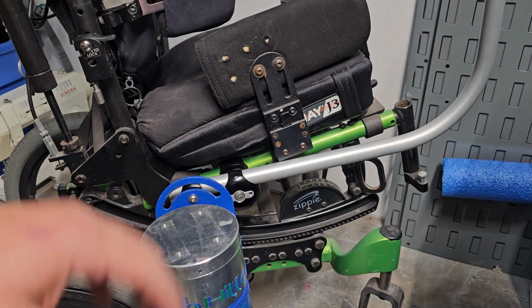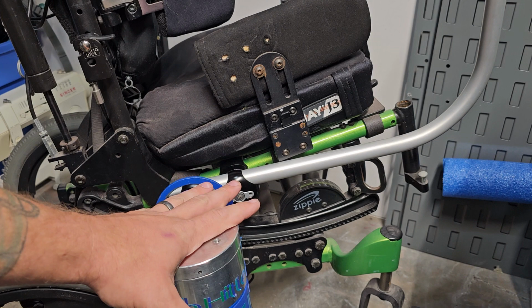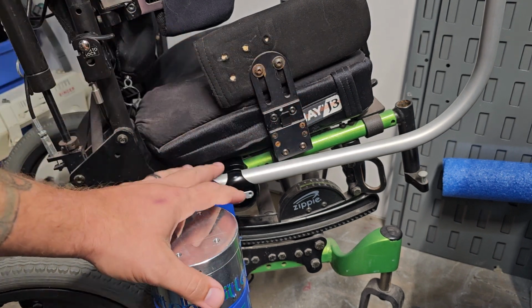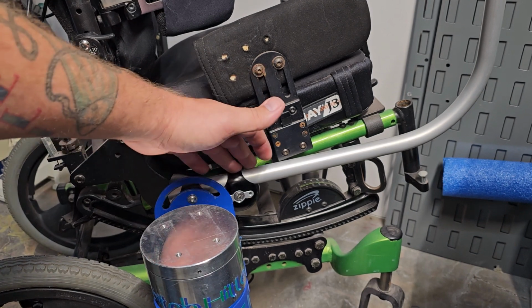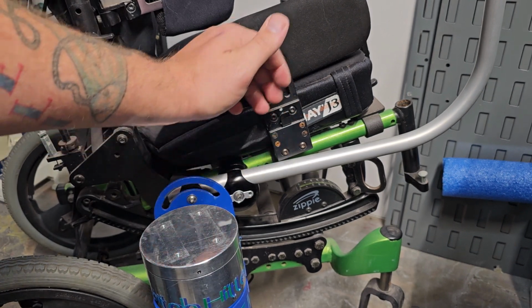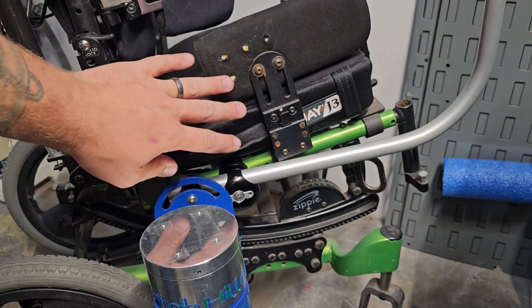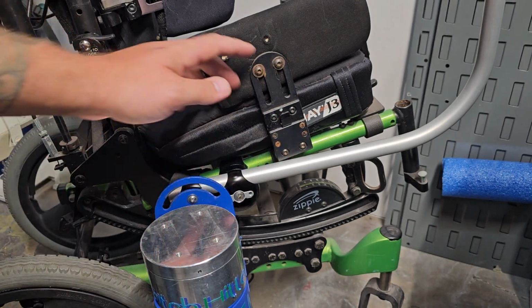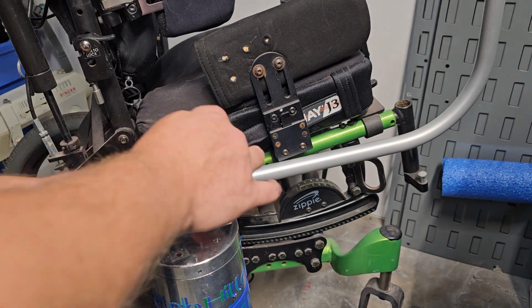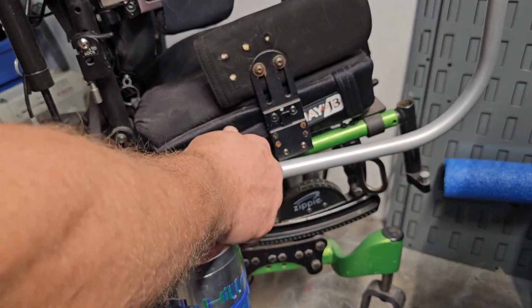Now you can do this multiple ways. You can do it like we just did and put the bracket, the bar, then the switch hitter on. Some people put this bracket on the bar and then put the switch hitter on the bar and then just put this piece all onto the wheelchair at one time, since it's just one bolt. That is all up to you and how you want to do it. This is just one way.